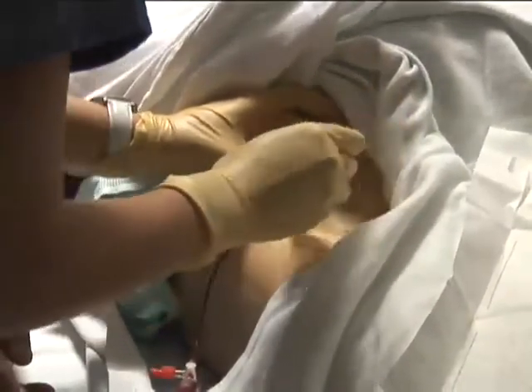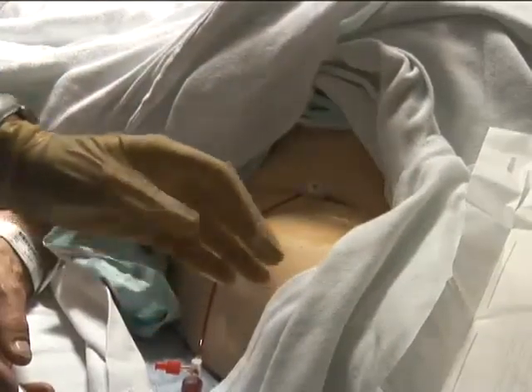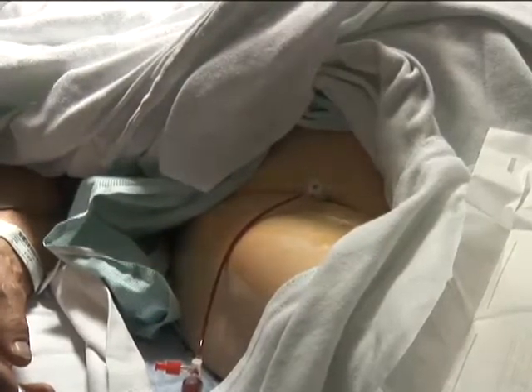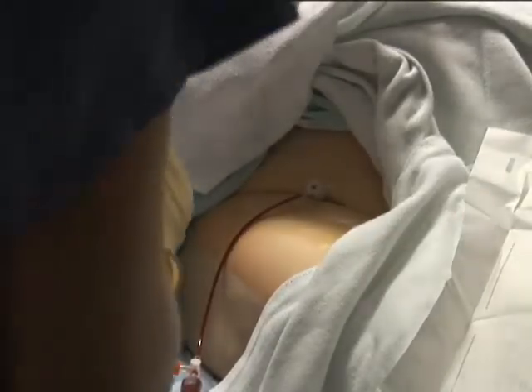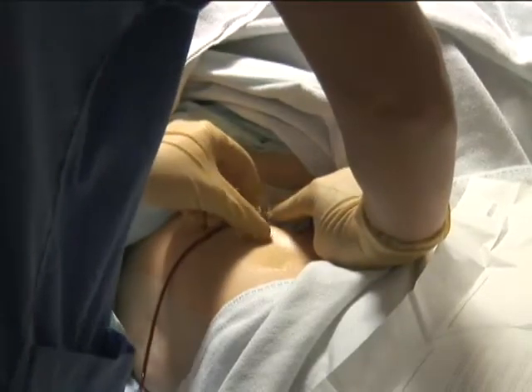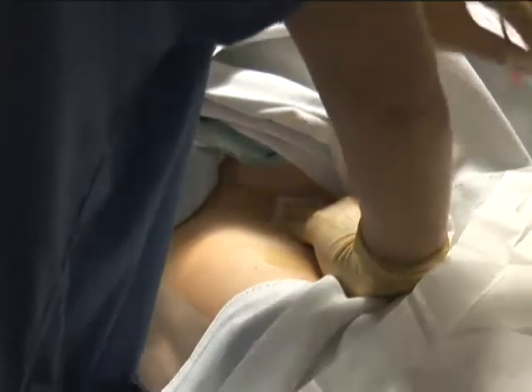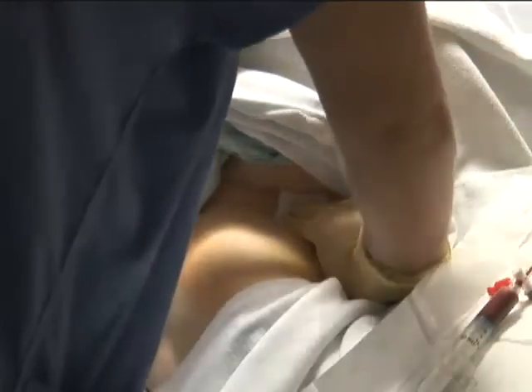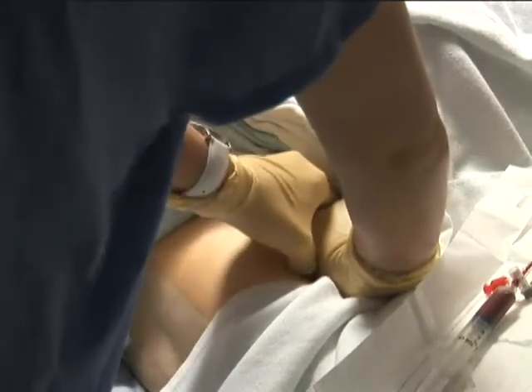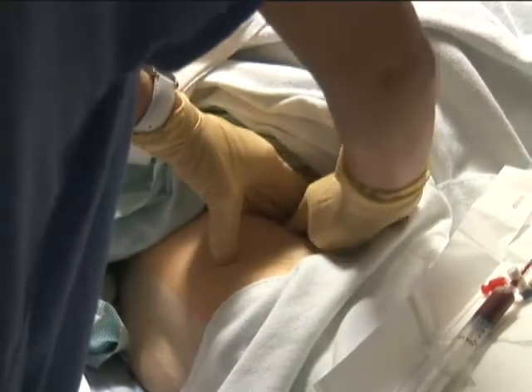Prior to sheath removal, the area is cleaned with a sterile cleaning solution. The area immediately above the sheath skin entry site is palpated to feel for the femoral artery. While holding pressure on the femoral artery above the sheath at the approximate area of arterial entry, the sheath is removed. The area is allowed to backbleed for 1 or 2 beats, and then firm and steady manual compression is held. Underneath the skin, the artery is being manually compressed up against the femoral head, which provides a solid surface on which to assist in manual hemostasis.